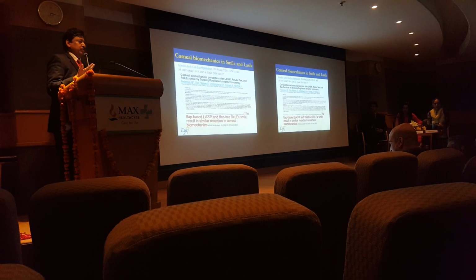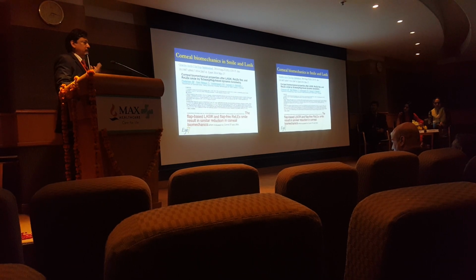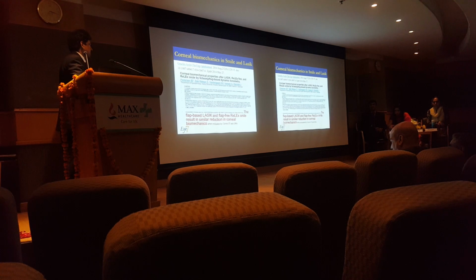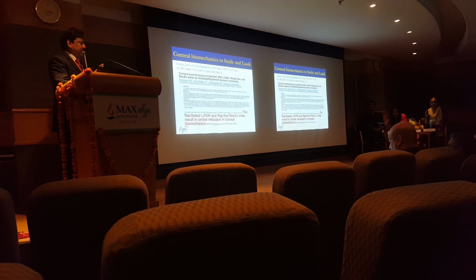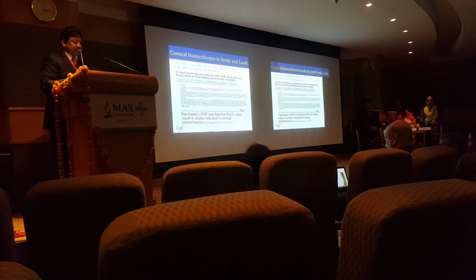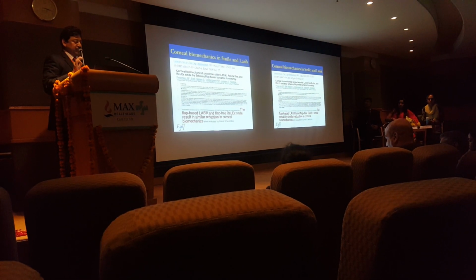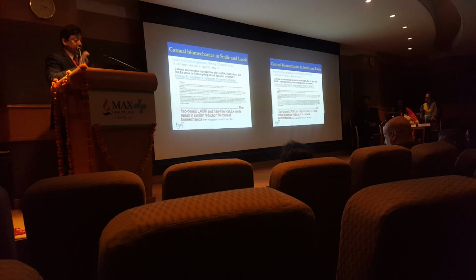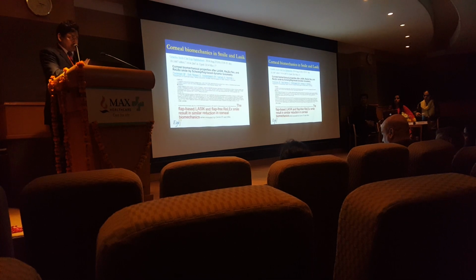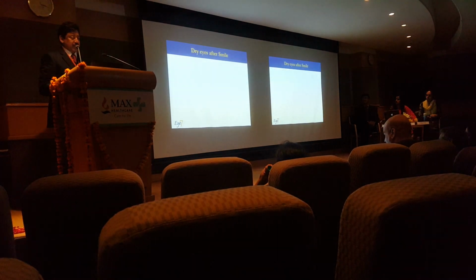Then, of course, SMILE talks about corneal biomechanics, that our system is made in such a way that we have better corneal biomechanics. Studies show that there is no difference. The flap-based LASIK and flap-free ReLEx SMILE result in similar reduction in corneal biomechanics. And there are a number of papers, I'm just quoting one. So there's no difference in corneal biomechanics.